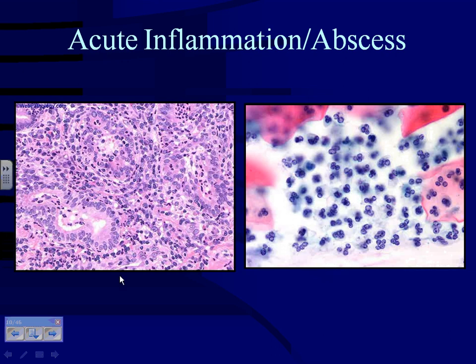Now, neutrophils by themselves on pap smear are not specific, okay? Remember, because you can see some neutrophils on pap smears commonly. But when you see a lot of them, so much so that they're covering the squamous cells, obscuring the squamous cells, causing reactive changes to the squamous cells that we'll talk about on Monday, that's indicative of real acute inflammation happening in that setting. So in other words, the inflammatory cells can be there, but unless they're causing a cellular response, it's really not a true inflammation.